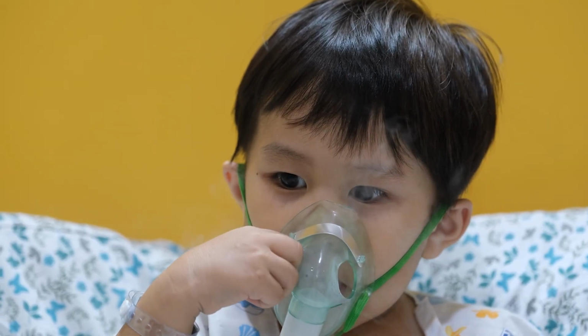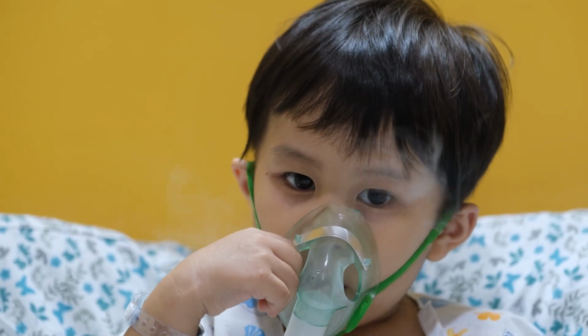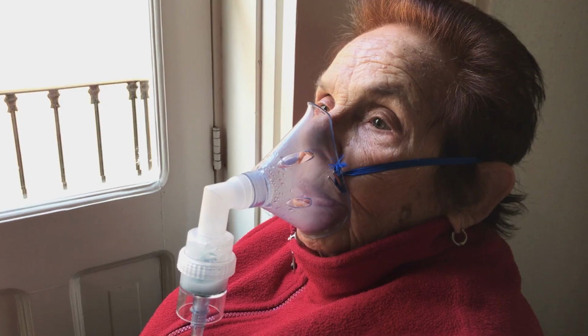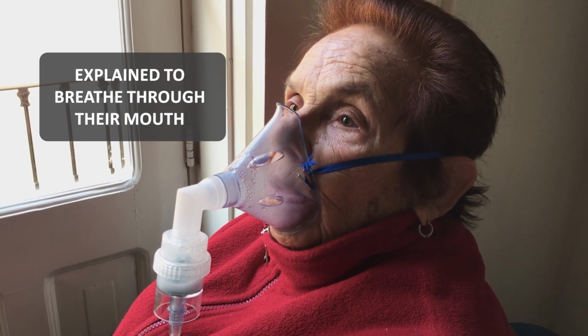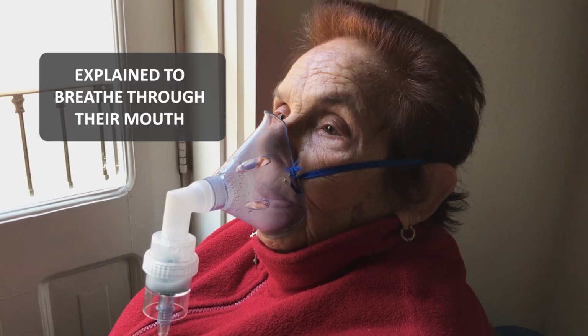Regardless of whether the patient is using a mouthpiece or a face mask, the patient should always be breathing normally, in and out through their mouth. Adults and older children should be told to breathe through their mouth, as droplets might be caught in their nasal passage and less medication can be delivered to their lungs.